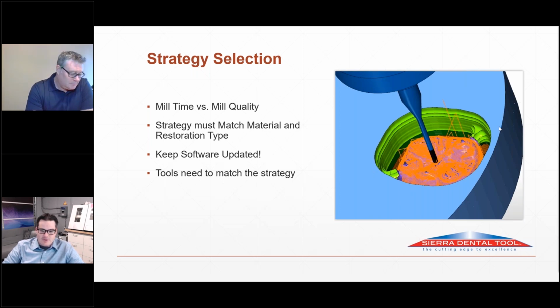If your tool doesn't match the shape of the tool in the software, when it's calculating, it's trying to avoid collisions with material in the part. And if it doesn't expect the correct shape of the tool, it can slam it into the material. It can slam it into the sprue, and what that does, it overloads the tool and causes a breakage. So as a rule of thumb, if tools are breaking, it's a symptom of another problem, and it's usually pretty easy to clear up. The tool's either being overloaded or it's being hit on something.